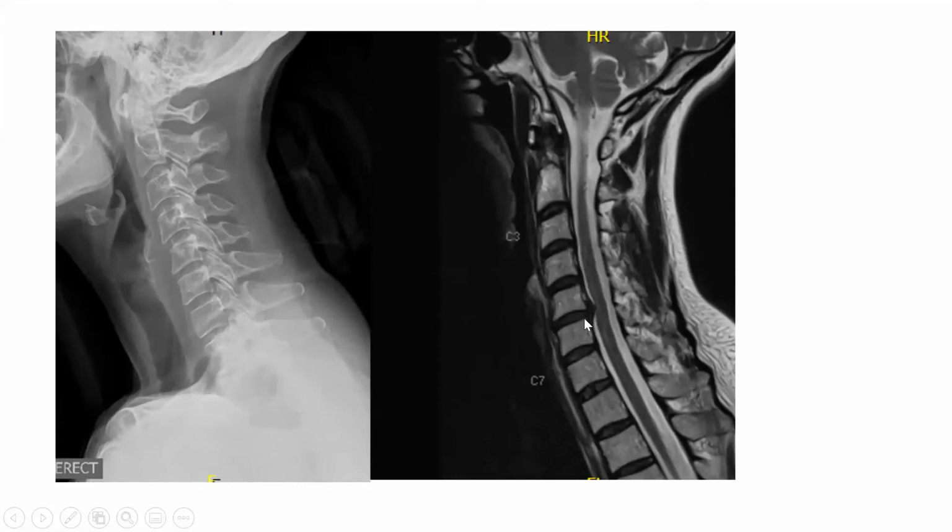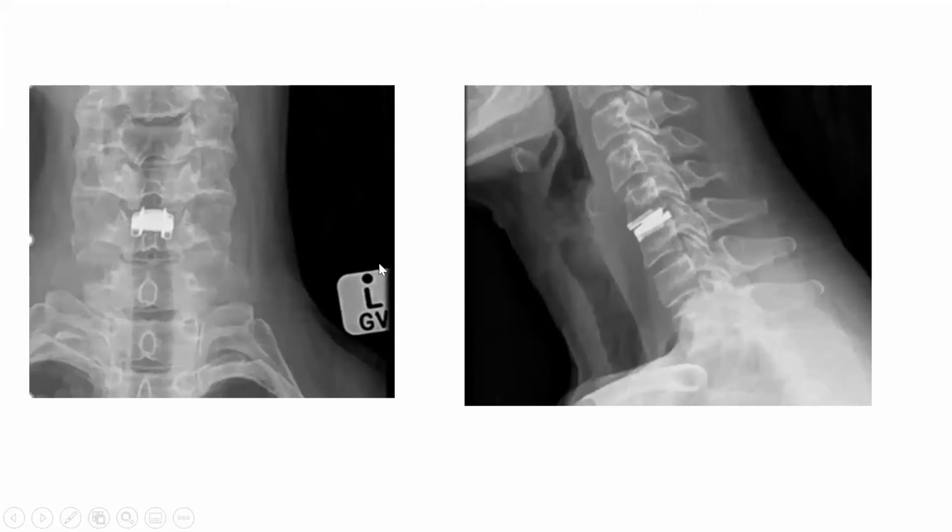So probably a younger patient, he has less degeneration. And you know, my default is to do a disc replacement. This is a total disc. It's 2 flat surfaces, and it's got a metal bearing. And this is a motion preserving device. Patients just seem to do better with it. You explore the whole space, there's almost never any recurrence, and they do very well. This is a disc replacement.